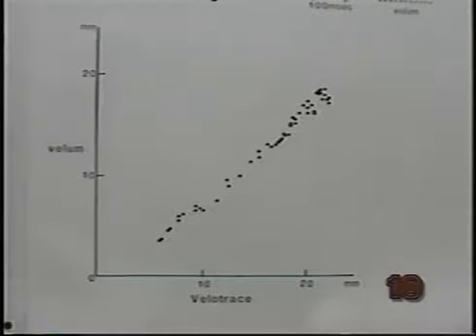The very high linear correlation between these measures is reflected in this scatter plot and the correlation coefficient of 0.993. In addition, velocity measures obtained from our velotrace data were consistent with velar velocity data reported in the literature. It appears that movements of the velotrace reflect the movements of the velum itself.